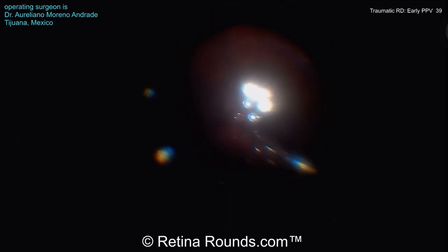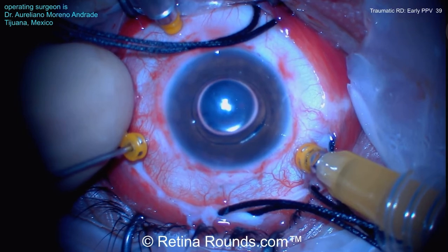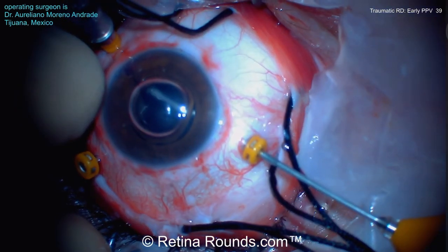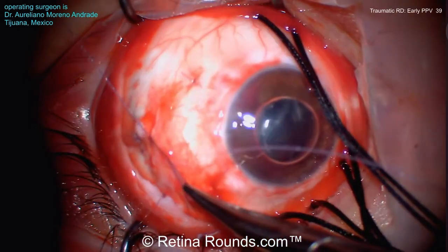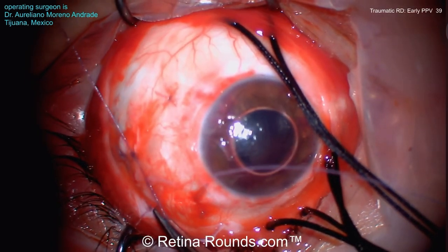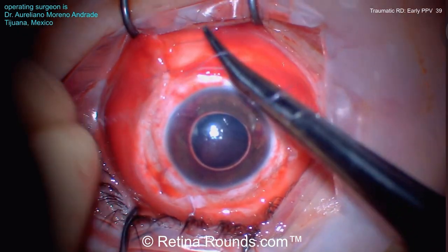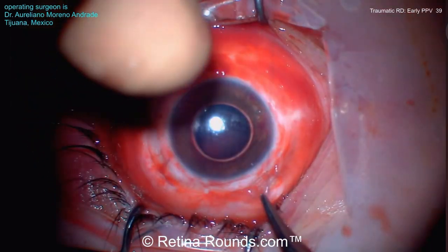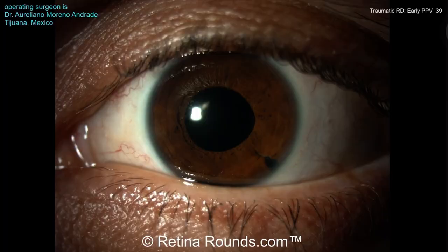Here he's done an air fluid exchange and now putting in silicone oil. You can see that the retina looks like it's nicely flat under air and under silicone oil. An inferior PI is created. This patient is aphakic, so that's going to help decrease the risk of pupillary block. And then the lateral rectus is brought back to its normal position, and the conjunctiva is closed. That's very nice, bringing the conjunctiva back to its normal anatomic position.